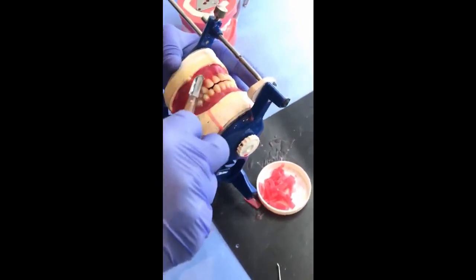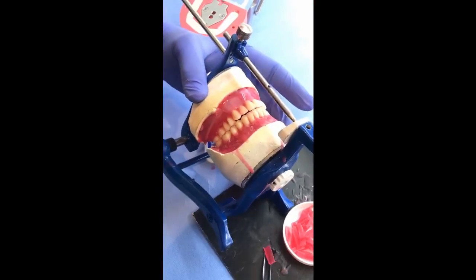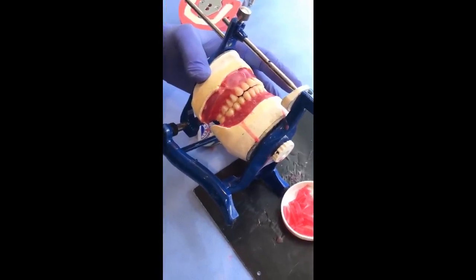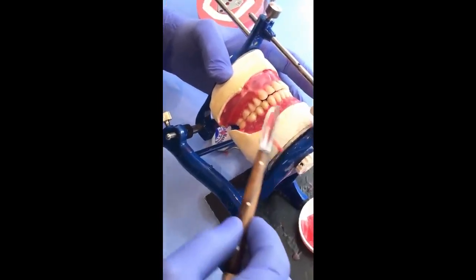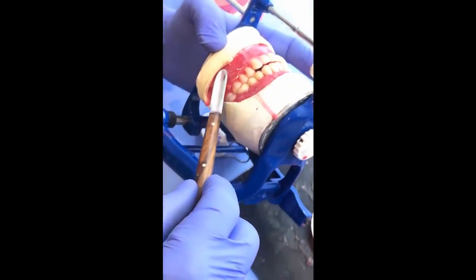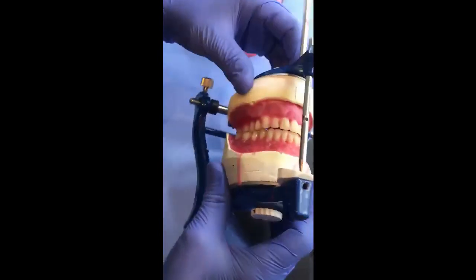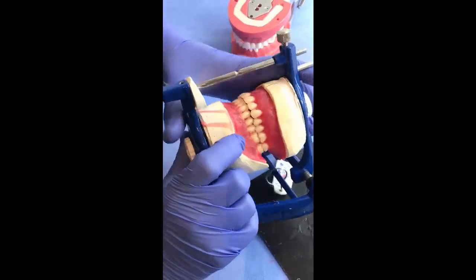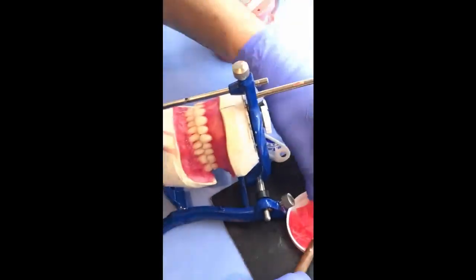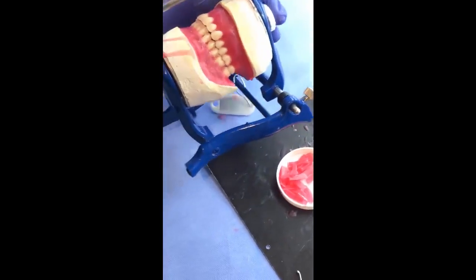Now, this is the technique we are going to use. Now, the added wax will extend from the gingival third of the teeth to the borders of the record base to the area of the cast. Now we added here a sufficient amount of wax. You can increase the amount of wax to the area as much as you need.